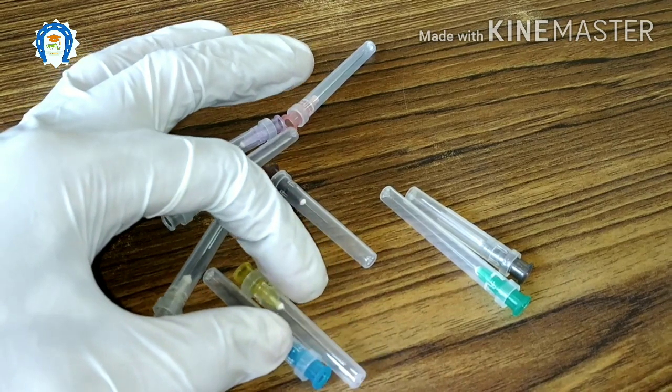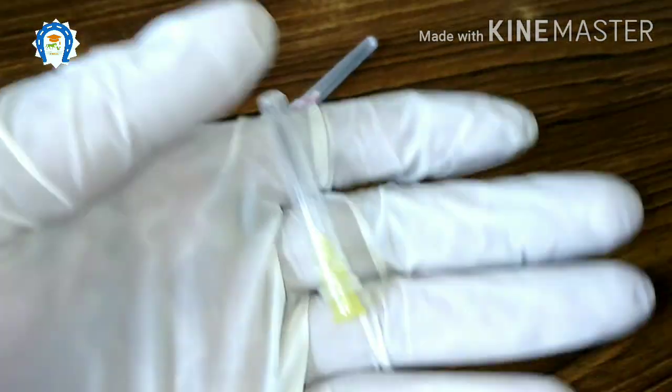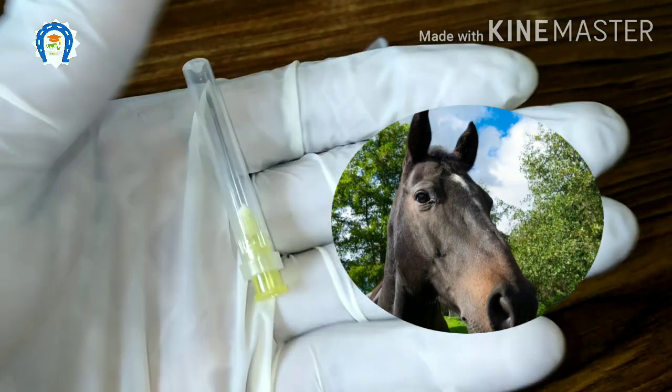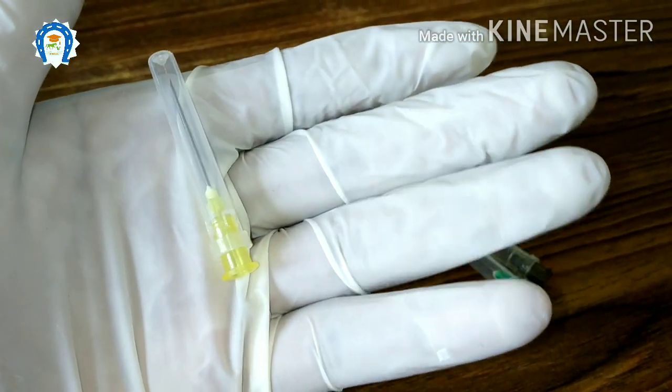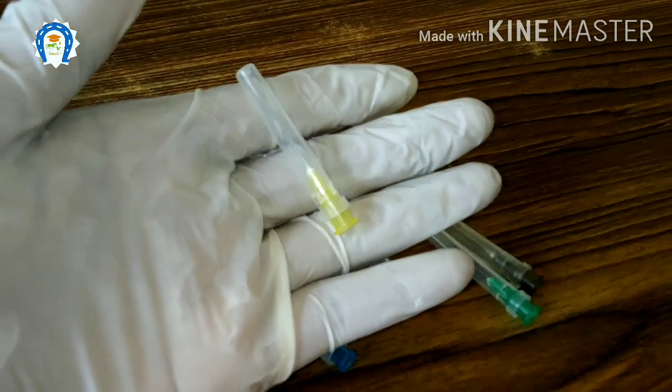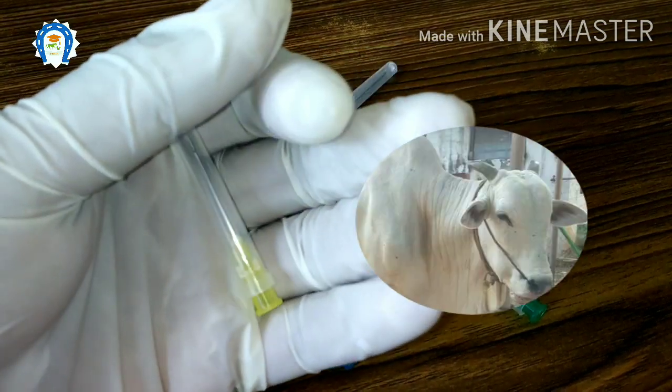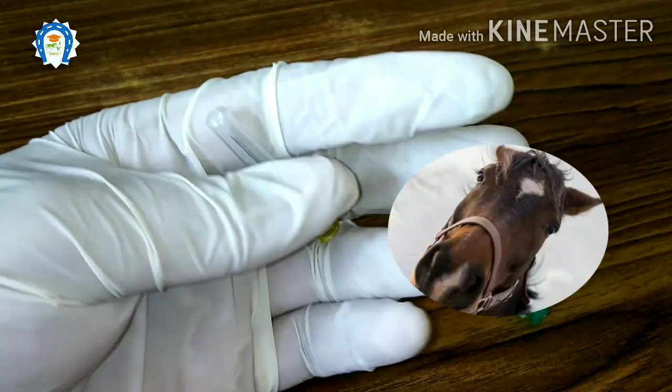This is the 20 gauge needle, yellow in color. We commonly use this in our practice. This is suitable to give intramuscular and intravenous injections in horses. In cows, sheep, and goats, we can use this to administer fluids. This is the ideal needle to give epidurals in cattle, buffaloes, and horses.